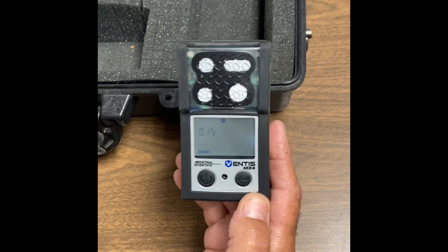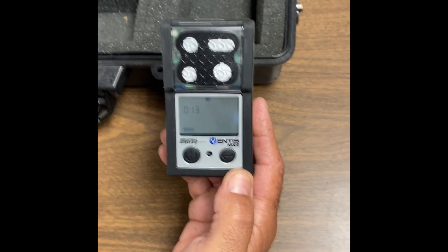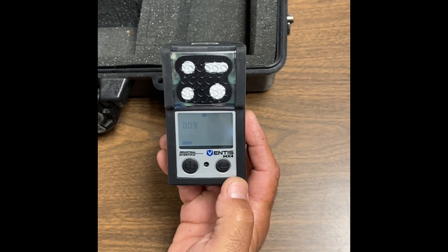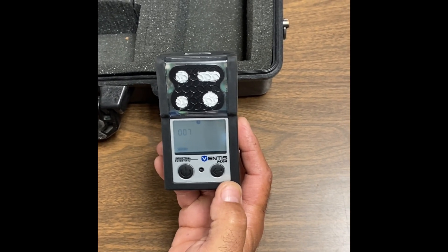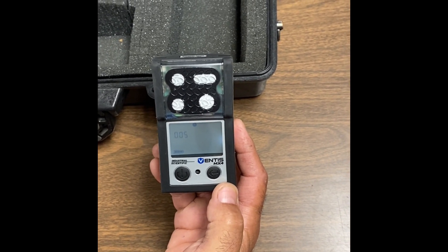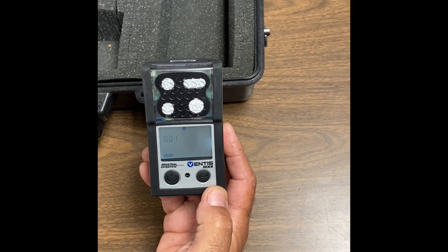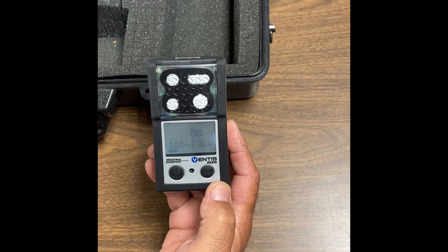Once you do that, it's going to go through its countdown. You'll just wait for it to go through its countdown. And then once it's gone through its countdown, our next procedure is to do a fresh air calibration.